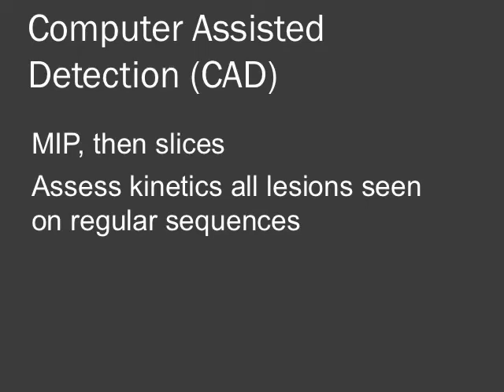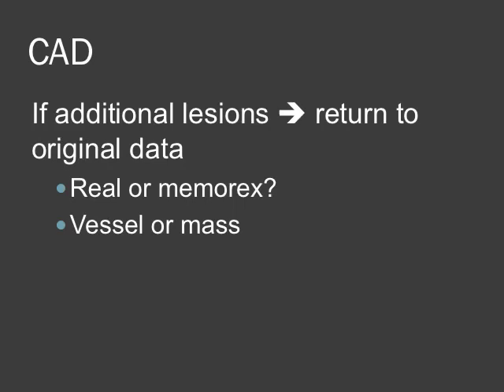I haven't mentioned looking at the kinetics of the enhancement yet, and we really like to do this right at the end to make sure we've looked through all the images and we're not biasing ourselves by looking at that kinetic study. I find it most helpful to look at the MIP images first and then look at the individual slices, looking for areas of enhancement. We're going to assess the kinetics of all the lesions we saw during our initial review of the gadolinium-enhanced sequences, and then also look out for any additional lesions. If we see additional lesions on the CAD images, we'll return to the original data and try to assess: is this real or artifactual? Is this a vessel, a mass, or a normal lymph node that we passed over on our initial review?